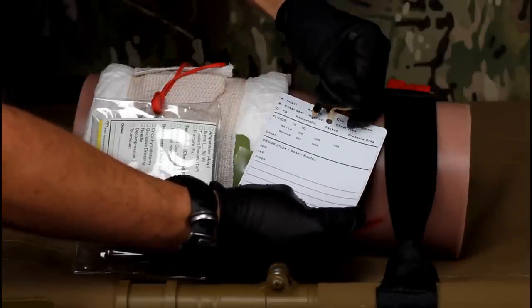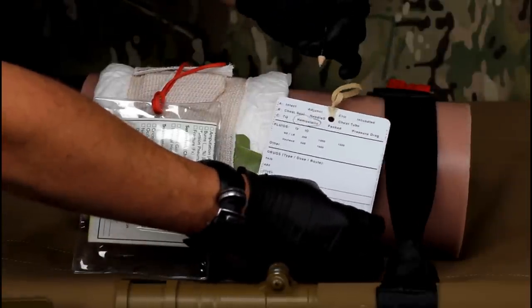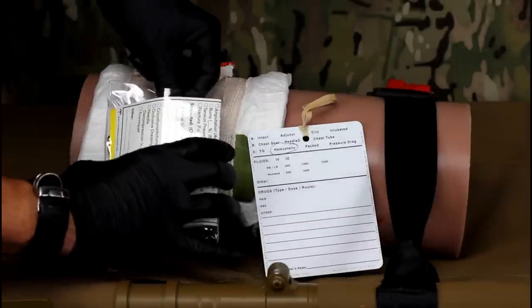Prior to patient transport, do not forget to mark the casualty card in the appropriate location, indicating that a hemostatic agent has been used.